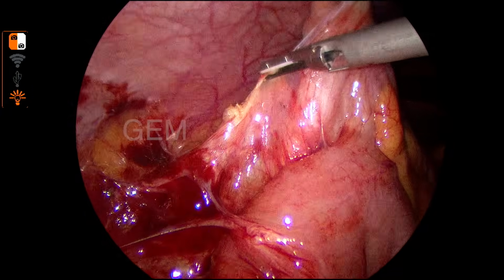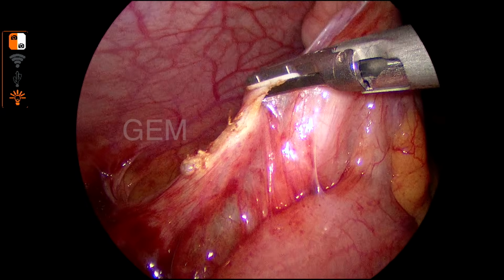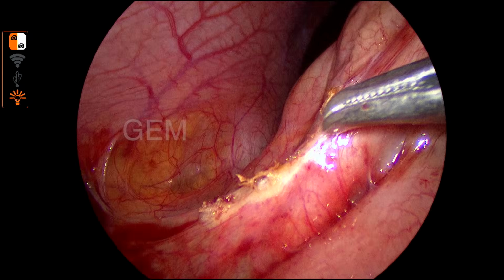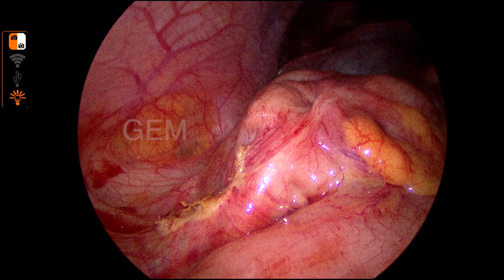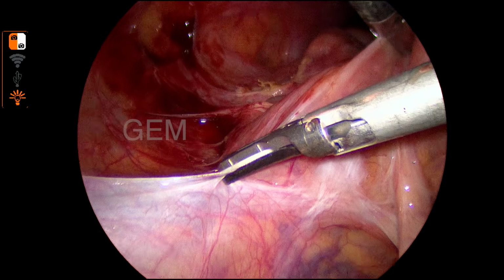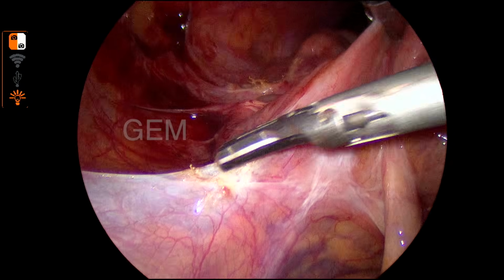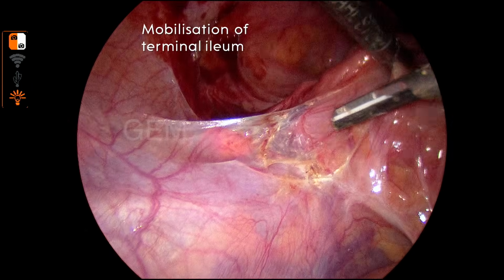So you can see it's very close to the cecal wall. He is working, but that is not the ideal place. Don't try to mobilize the cecum laterally. Instead, mobilize inferiorly and then go behind the cecum. Posterior mobilization of the cecum is always ideal. Now you can see I started, and my left hand is always ready with Carlson forceps. I don't use a bowel grasper most of the time, and so now I hold the ileum.